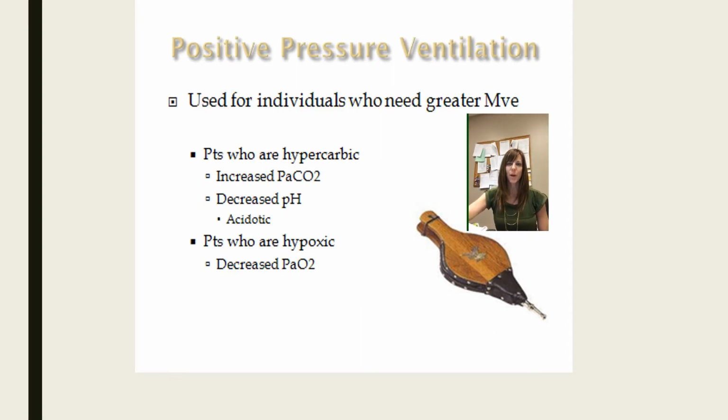I know we haven't talked about indications for ventilation, so we'll talk about it real quick here. What's listed on this slide is minute ventilation. If somebody is not ventilating, they need a ventilator. Somebody who's not ventilating may be apneic, they're not breathing at all, or they may not be ventilating enough. For example, their CO2 is too high. So if somebody's minute ventilation is not high enough, they're going to need a mechanical ventilator. That is, if they're not ventilating, they need a ventilator.